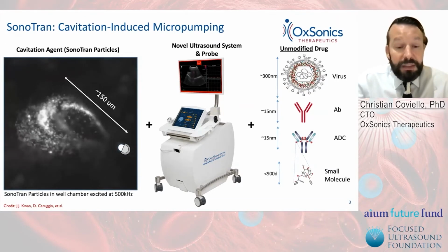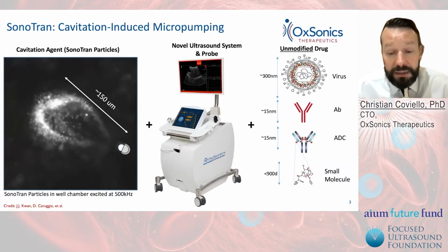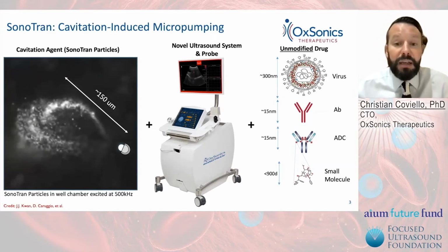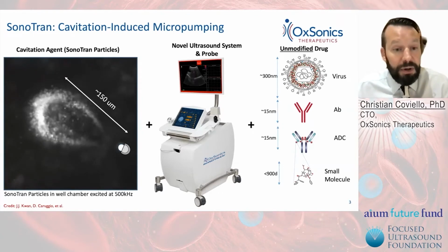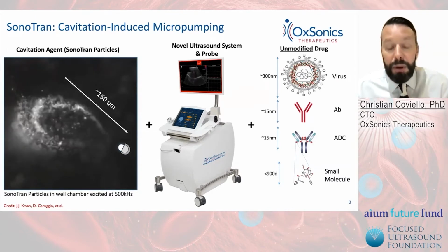For particular reasons that I'll go through later in this talk, we developed our own ultrasound system so that we can ultrasound image to find solid tumors. We can then deliver focused therapeutic ultrasound to cause cavitation from our cavitation nuclei, to cause this micropumping, microstreaming, to pump more drug.